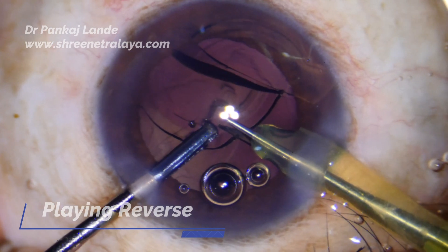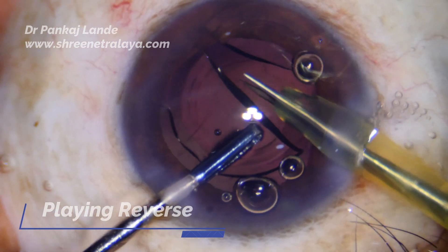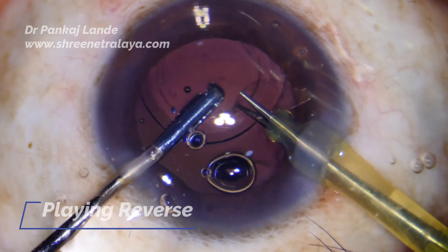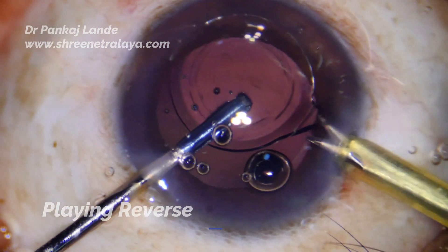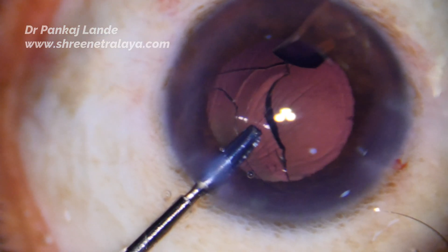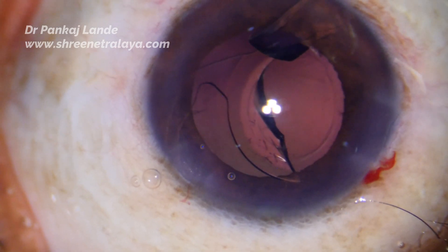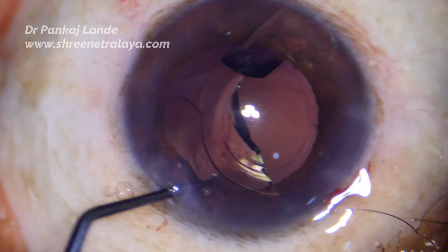The first cut was awesome as I can see on reverse playback. One can pull the IOL towards the instrument rather than taking the instrument to the periphery of the anterior chamber, which reduces the risk of posterior capsule tear — though that depends on experience. Now I have two remaining pieces in the anterior chamber which can be very well removed with micro forceps — hold each piece separately along its length and remove them.